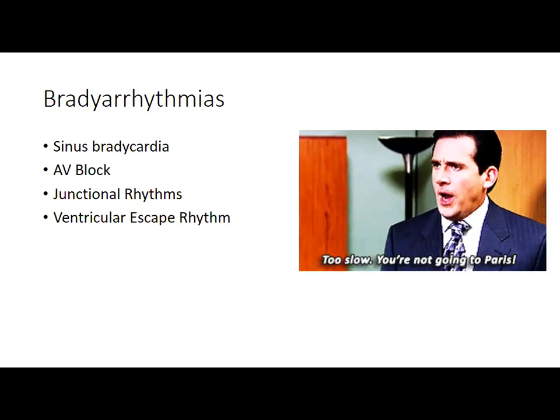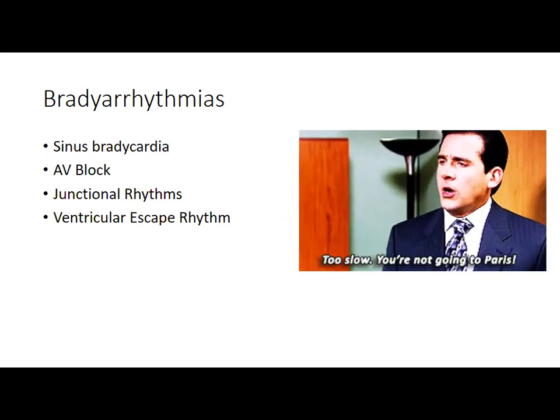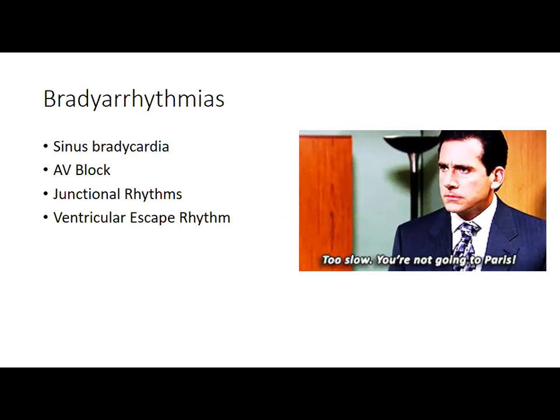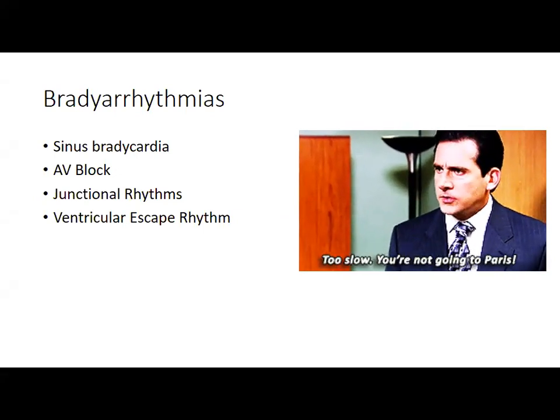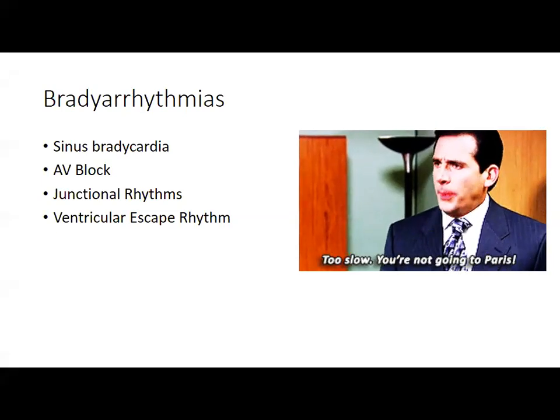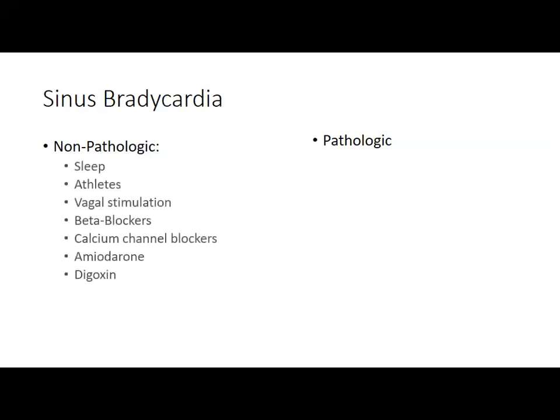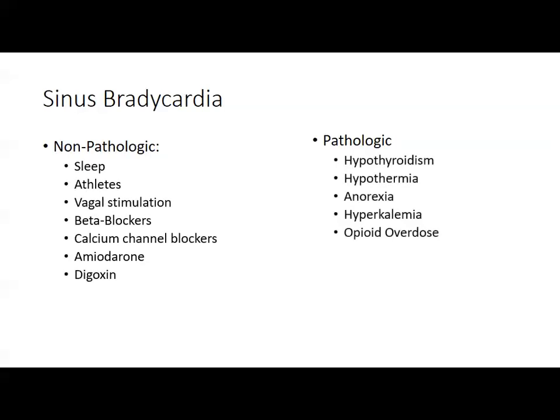Okay, bradyarrhythmias. Just want to talk about them a little more quickly. They are a lot fewer than our tachyarrhythmias. They're sinus bradycardia, AV blocks, and then our escape rhythms. So sinus bradycardia. There are non-pathologic and pathologic causes of being sinus brady.